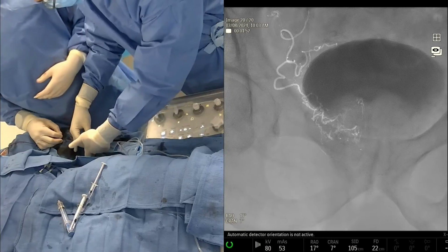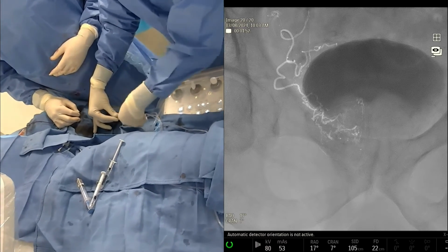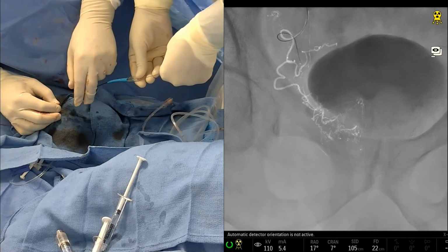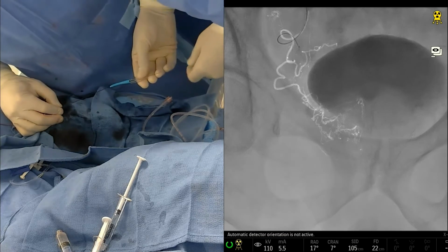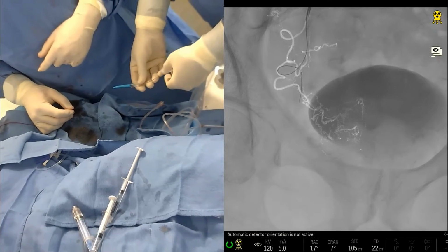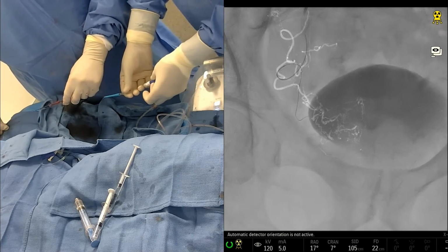Thank you. Not bad. So one of the things I noticed when I looked at that angio very quickly was that the bottom part of the prostate is not filling on that angio. So most likely that's that piece that we saw off the rectal. Which everybody noticed that there was something. That looks like the superior branch. Yeah. Let's bring this back a little. The roadmap's not going to be accurate anymore. But that little piece at the bottom of the prostate, which we see on that image there, that might be it, right? Yeah. Let's track and see what that is. I don't know. Well, let's see.